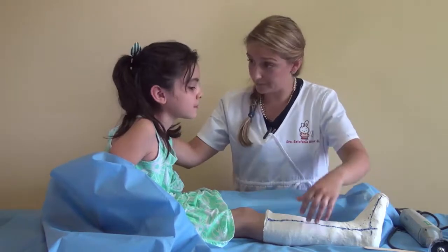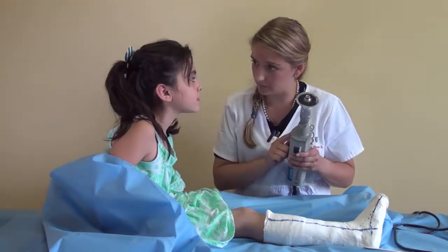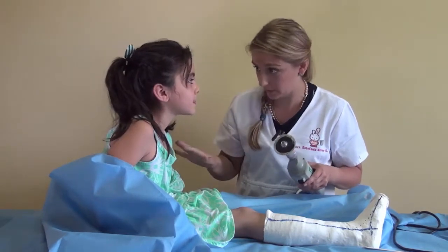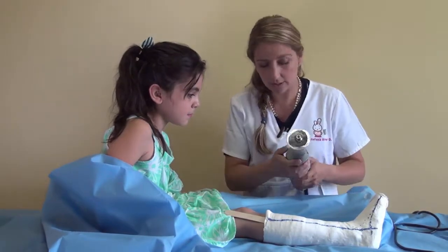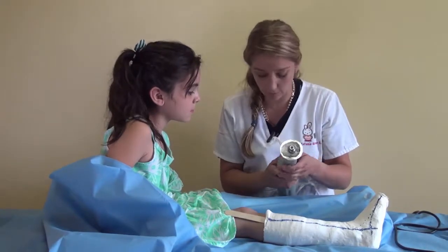Michaela, I have to remove your cast. Don't be afraid. I'm going to use this electric saw. It has a sound like the hair dryer of your mother, but don't be afraid. I will protect you with this tongue depressor. And you can see, this saw is so special that it cuts only the cast, not your skin.